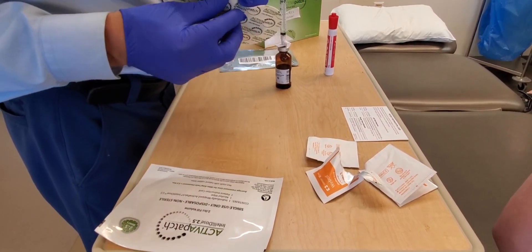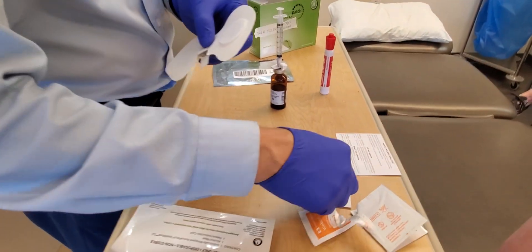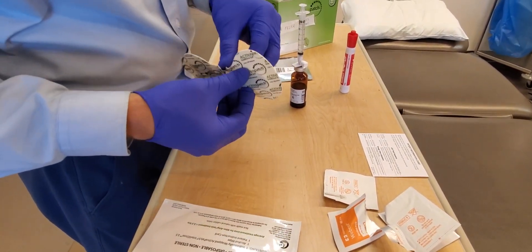We want to first ensure that our patch is going to be working for us. We have this little pull tab — pull it out, flip it over, and our light should be blinking green, which it is. So we're off to a good start.